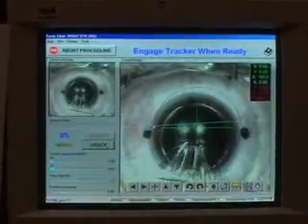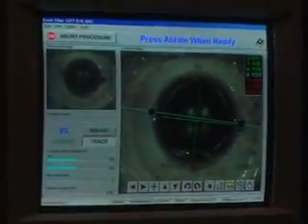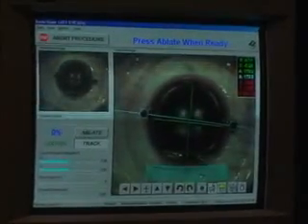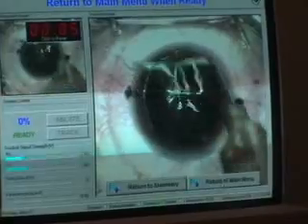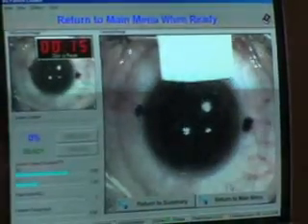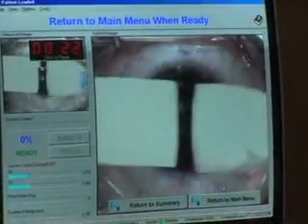After the flap is retracted, we are now going to register the treatment. We rotate the horizontal line, which is now oblique because of the cyclo-rotation, and the two circles are lined up over those registration marks, assuring perfect placement. The flap protector is then put in position, which protects it from inadvertent laser pulses. You can see the 0.9 millimeter flying spot of the laser there, and after the treatment, the flap is replaced. We quickly use micro-sponges after a very mild irrigation to remove interface fluid. This is an important maneuver to reduce flap edema and therefore wrinkles by avoiding over-hydration, and then we follow the vertical micro-sponge movement with two horizontal ones, which removes the interface fluid.